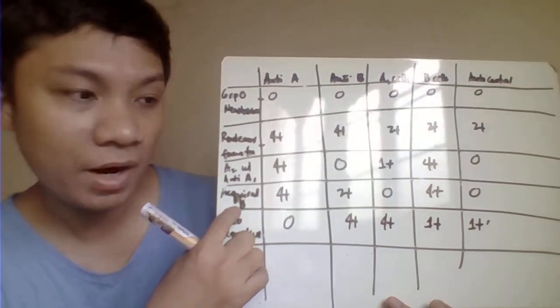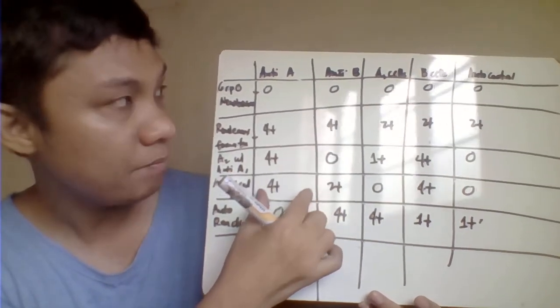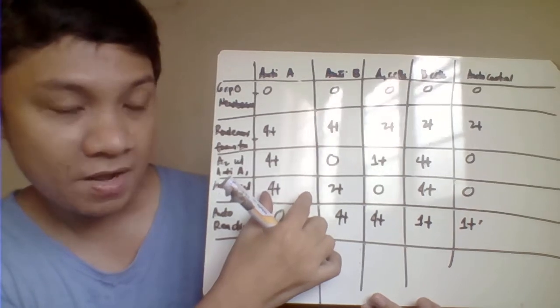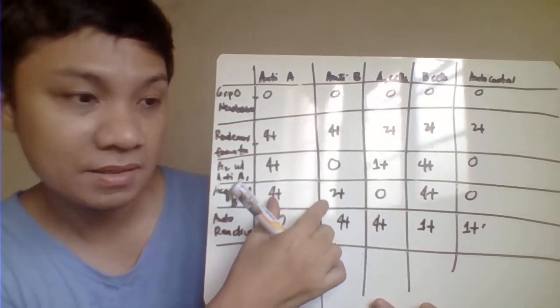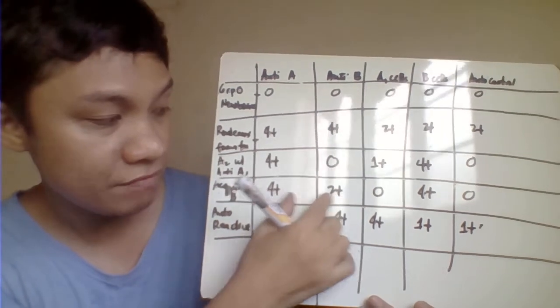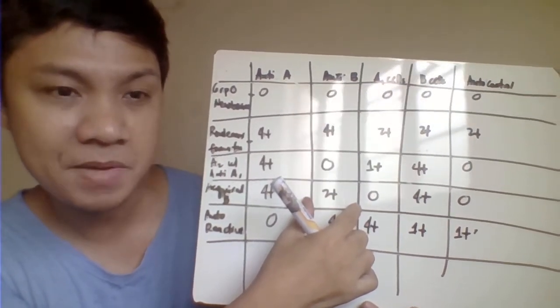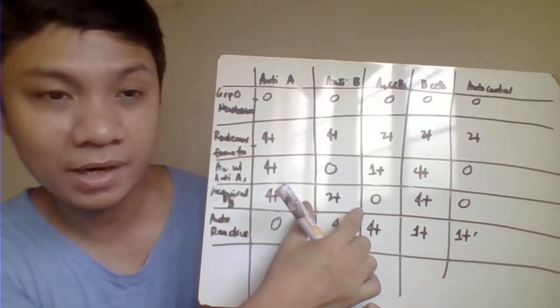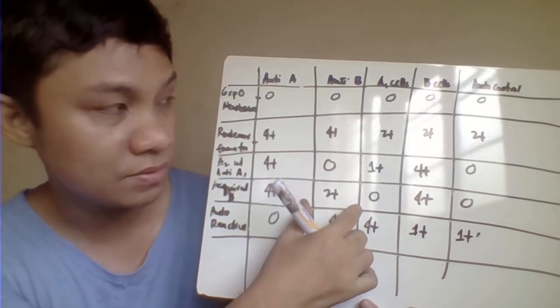Next, we have here acquired B phenomenon. So, we have the forward typing, 4 plus, saka 2 plus anti-B. Okay, so, pag acquired B, original na blood type ni patient ay type A, dapat dito ka lang mag-positive. Dito, medyo nag-positive siya sa anti-B, mean to say parang may B-like substance siya because it tried to acquire that by bacterial contamination, bacterial infections.